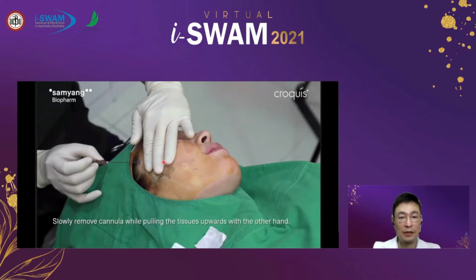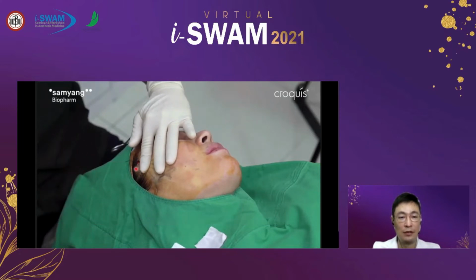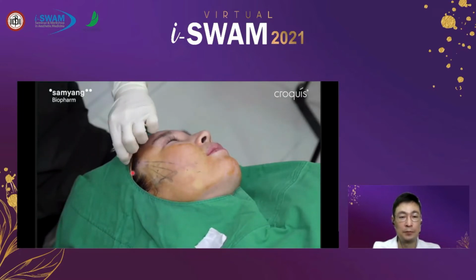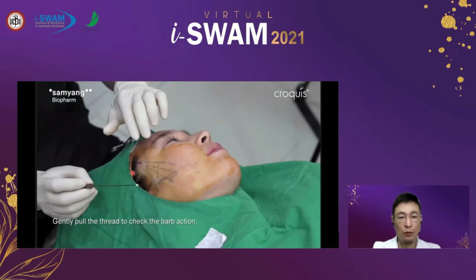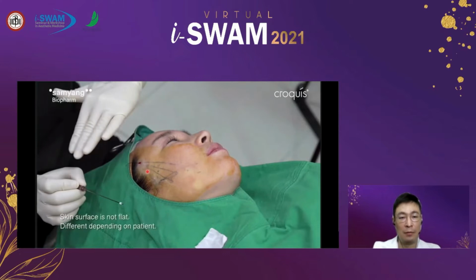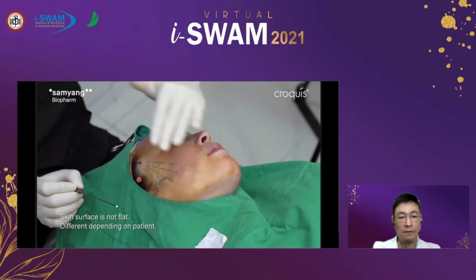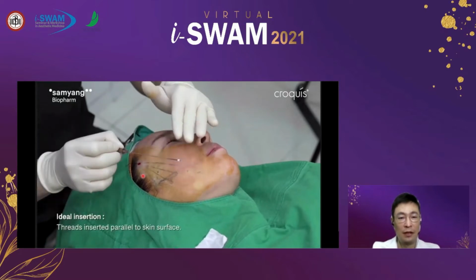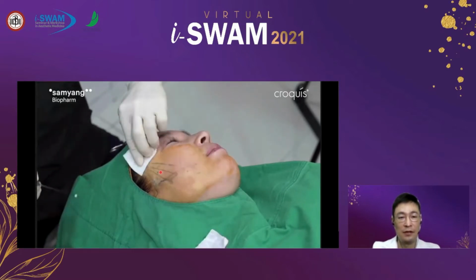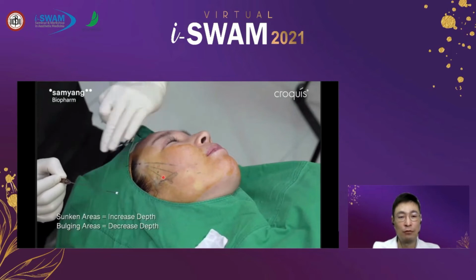When passing this ligament, you should advance your cannula a little lower than in other pathways, because if the thread is located too superficially, then after lifting, this sunken area may look worse.